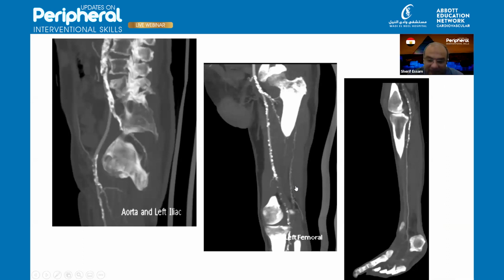We'll stop here and we can summarize the case. He is a male patient with all the risk factors for vascular involvement: diabetes, hypertension, ex-smoker, coronary artery bypass surgery, critical limb ischemia with gangrene. The CT angio shows a heavily calcified arterial bed from the distal aortic bifurcation up to the distality, with the symptoms mainly in the left leg, and we have a total gangrene.